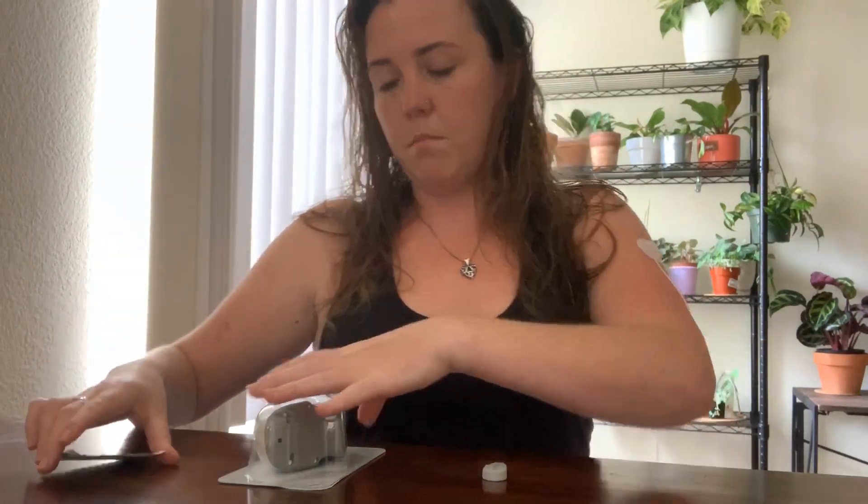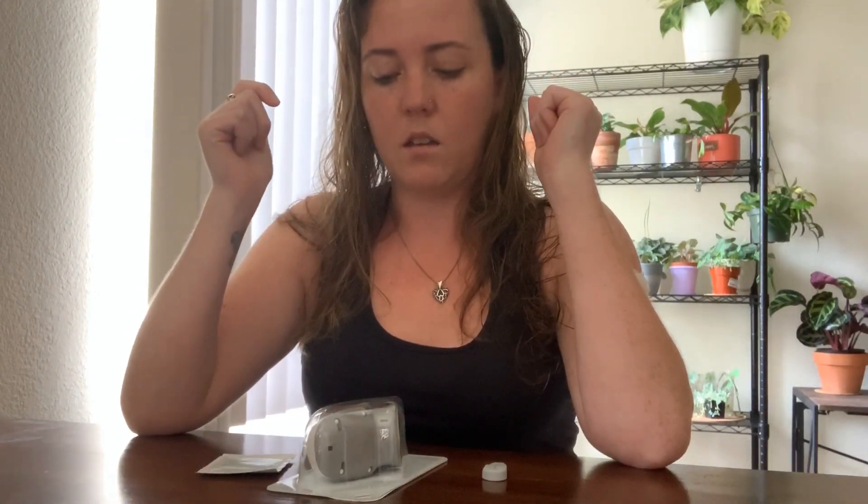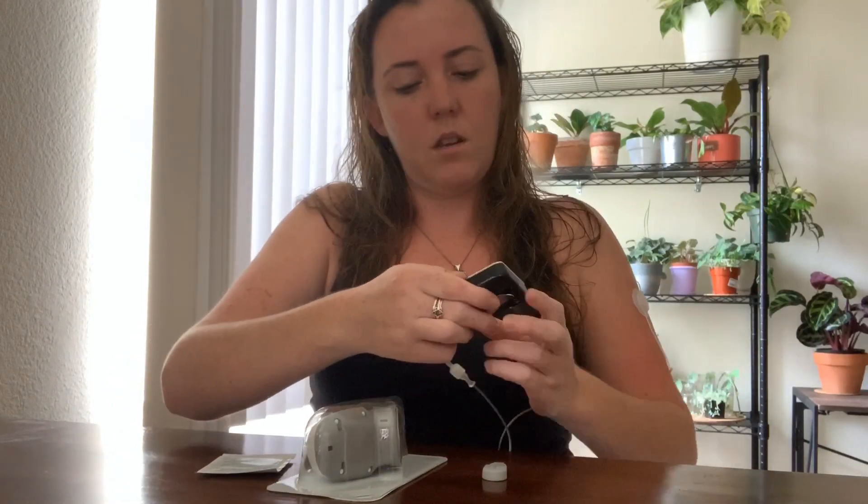My transmitter, my skin tac wipe, and my sensor. I'm going to be showing you guys how I put my sensor on my arm. I do always put it on the same side as my pump because I find that I get a better reading — the signal stays better if I have it on the same side.